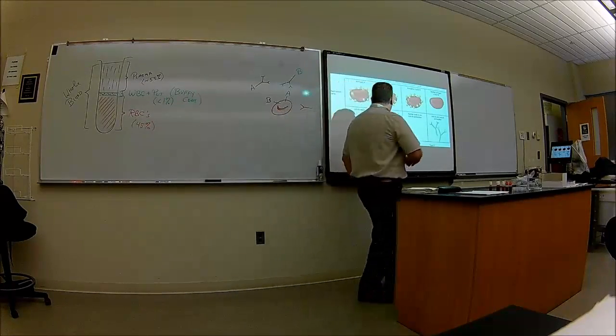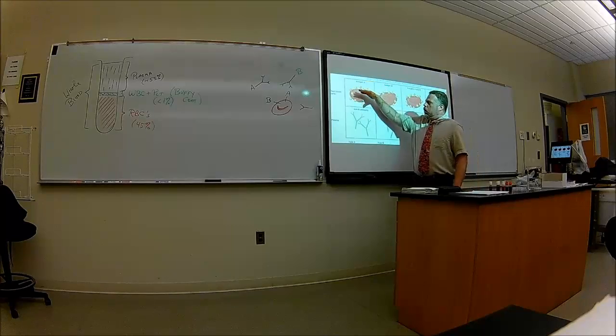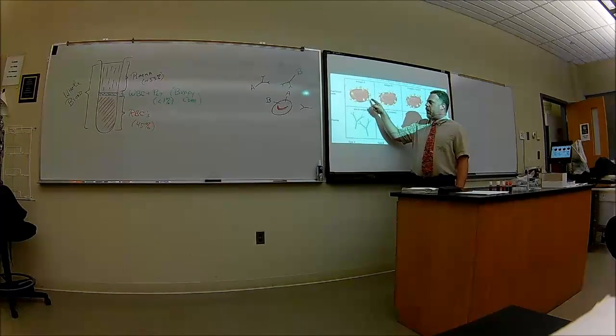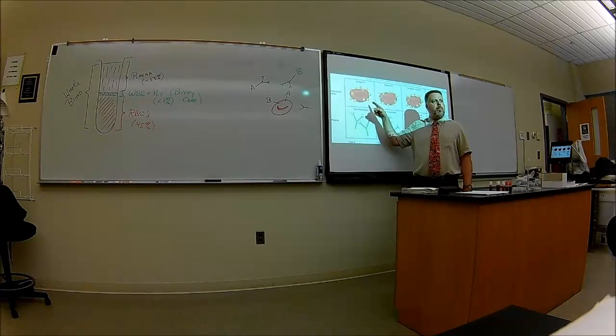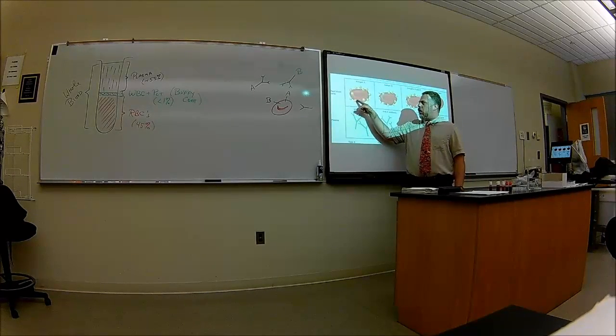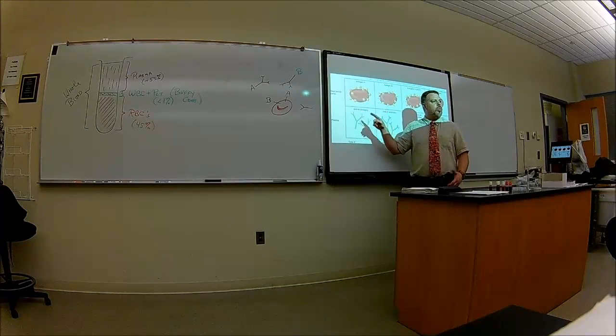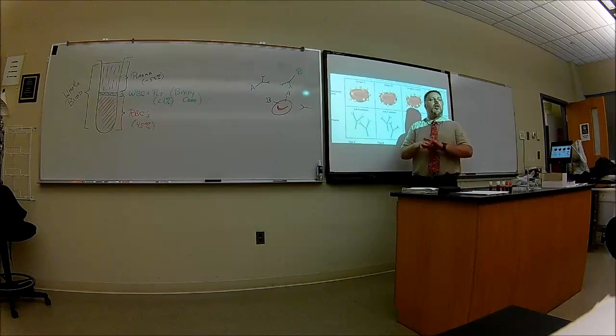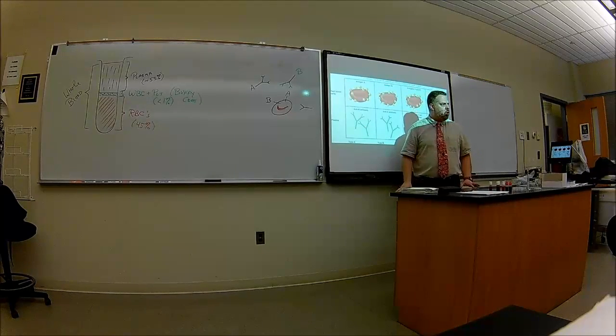Now, again, just to reiterate, this is blood type A. They have antigens to A, represented by yellow balls on here, and you have antibodies to B, which have a triangular pattern on here, that will not correlate with the balls on here. So these two, antigens to A, antibodies to B, can live in harmony. There's no issues with that. Are we okay with that?